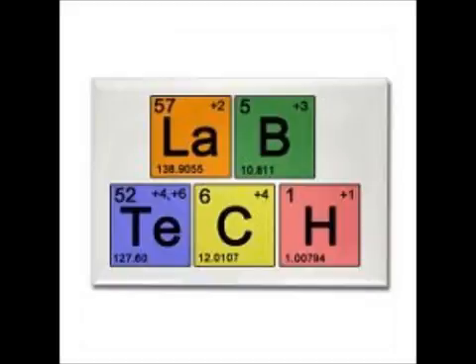So, what are the screening tests for platelet function, platelet problems? What is it for platelet number problems? What's the screening test? Part of a thing in hematology. CBC, the platelet count. If you're doing a platelet function screening test, you either do a bleeding time or a PFA 100.